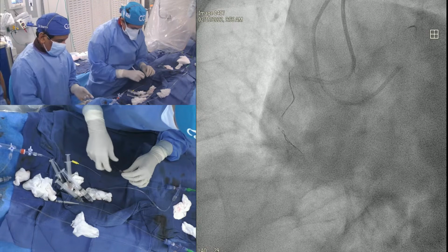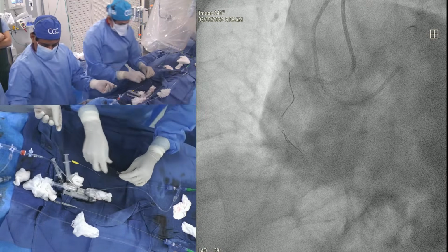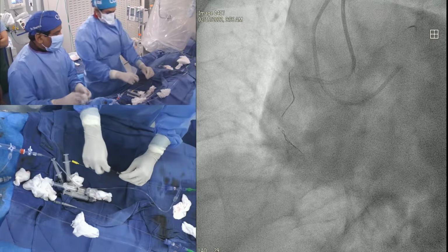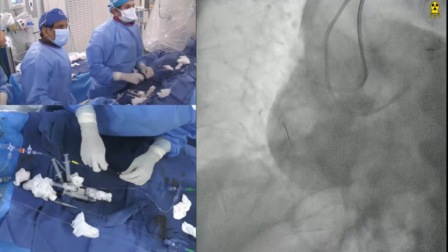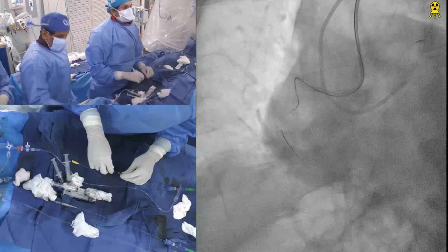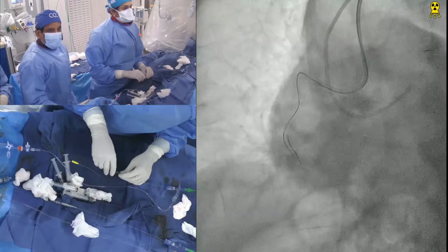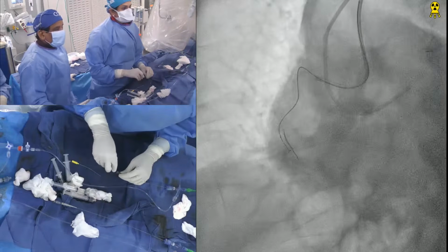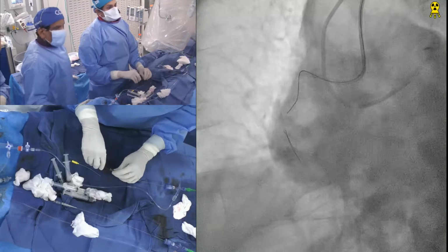Last wire has been going on for a long time. Thankful to the patient also so far. You know, many times what happens in these long cases is the patient's fatigue. Not even that, operator fatigue is always there, but patient fatigue is very big. They become very restless and saturation goes down. They start complaining. That's always the factor.